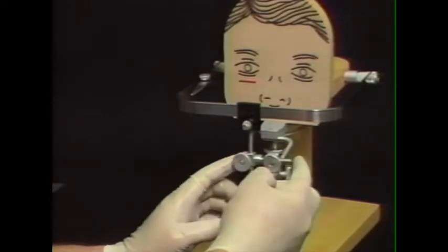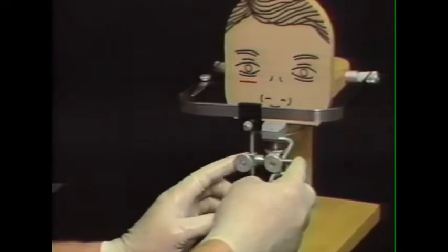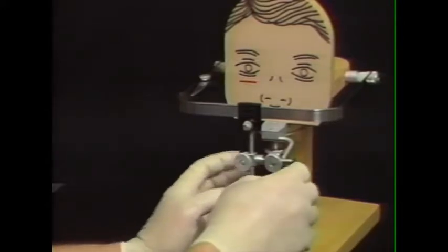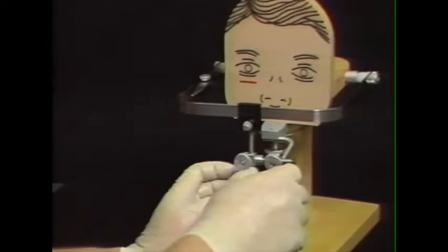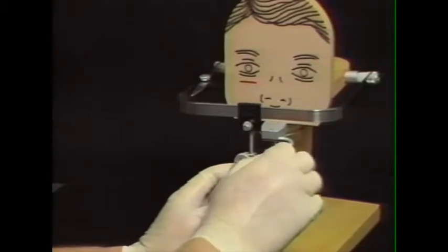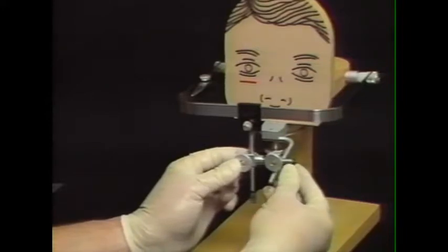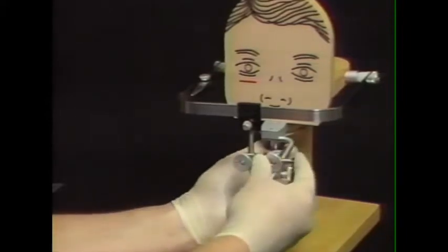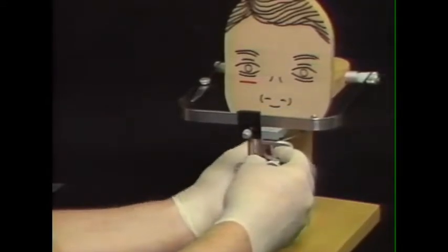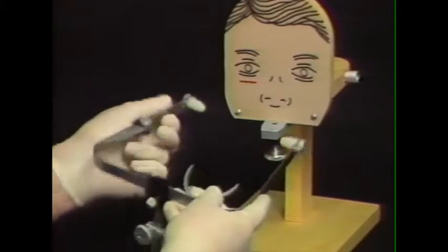We can now center the face bow by moving it from side to side. This centers the face bow laterally as well as anteroposteriorly. Once it seeks its level where it's not binding, we can then tighten nut number 2 and number 3. Now, all we have to do is have Harvey open his mouth here and release the bite fork, and we spread the ear rods and remove it from the mouth.